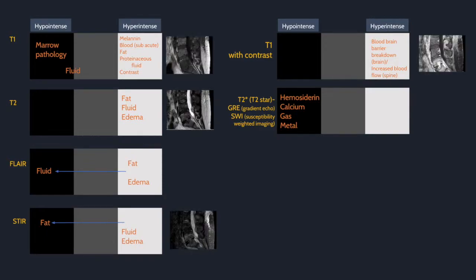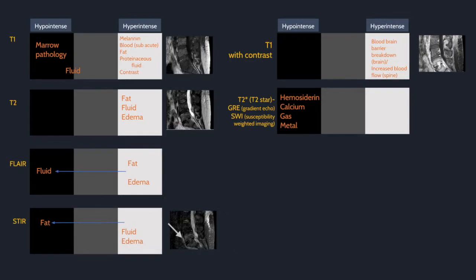With these sagittal images of the lower lumbar spine, it is similar. T1 shows bright subcutaneous fat and marrow, but dark fluid in the central canal. L5 and S1, however, are abnormally dark, which indicates some sort of pathology. With contrast, the marrow and disc space increase in intensity. On T2, the fluid in the central canal is now bright, and the L5-S1 bodies and discs show slightly increased signal. On STIR imaging, the normal vertebral bodies get darker, but L5-S1 stay bright, indicating fluid and edema. This is L5-S1 discitis osteomyelitis.